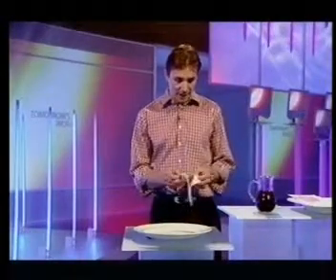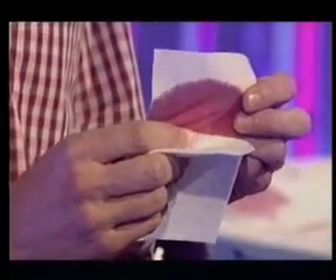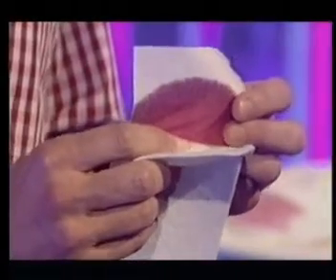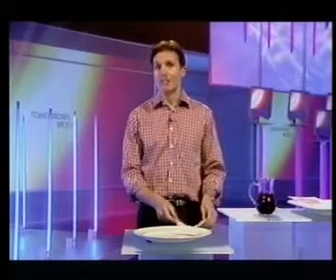The second layer here is made of a different material, an absorbent polyester cotton. This locks the fluid inside it, keeping the wetness well away from the wound face. Now, this means the wound is kept moist under here, but the surrounding skin doesn't get wet, which makes ideal healing conditions. Now, that's the theory, but does it really work?